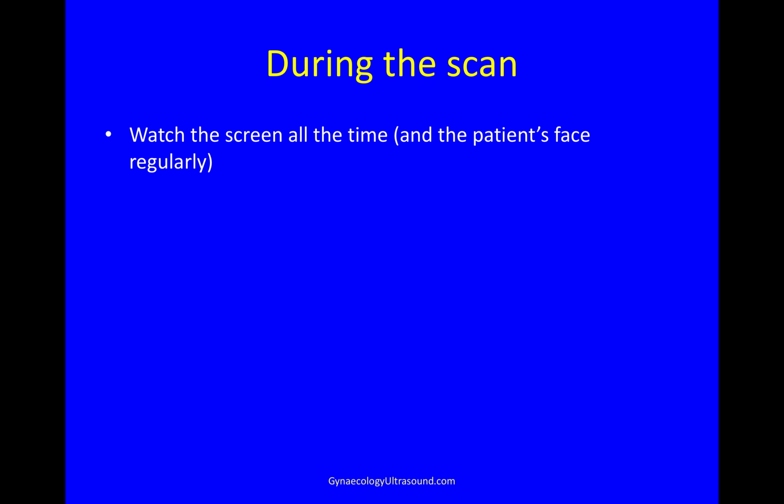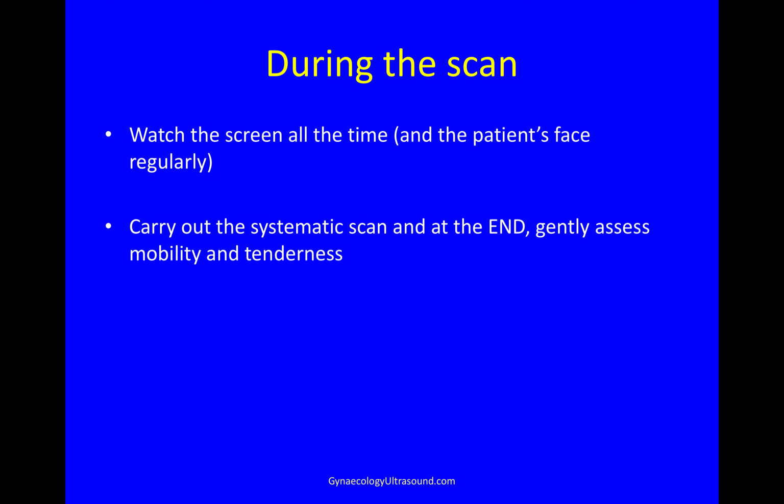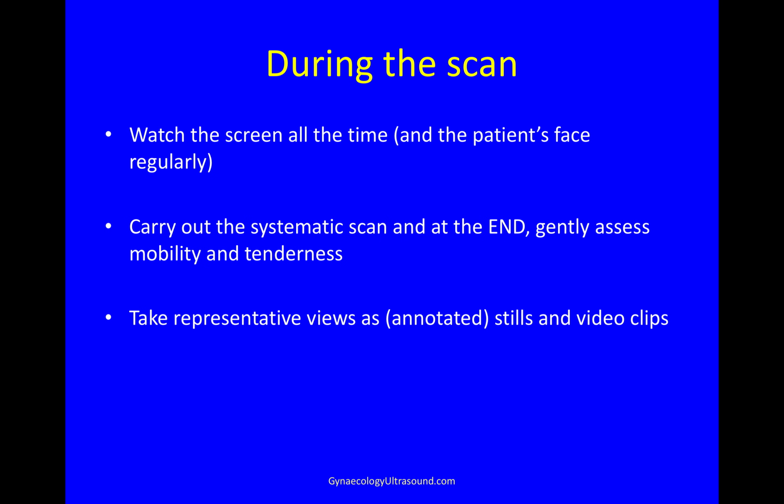During the scan, watch the screen all the time and the patient's face regularly. Carry out the systematic scan and then at the end, gently assess for mobility and tenderness. And take representative views as annotated stills and video clips. And be slow and gentle, that's the most important thing.